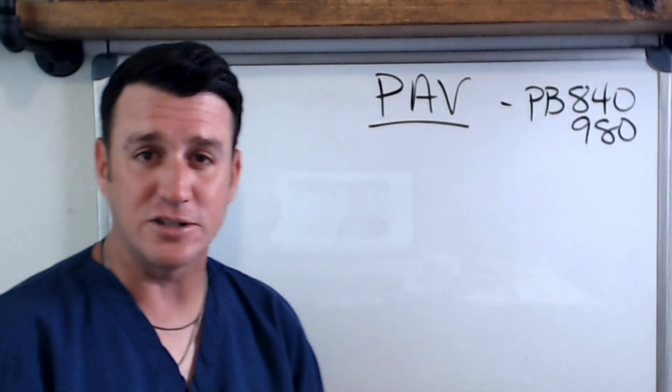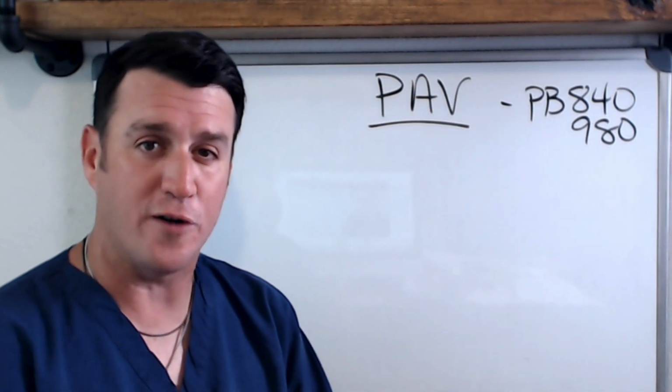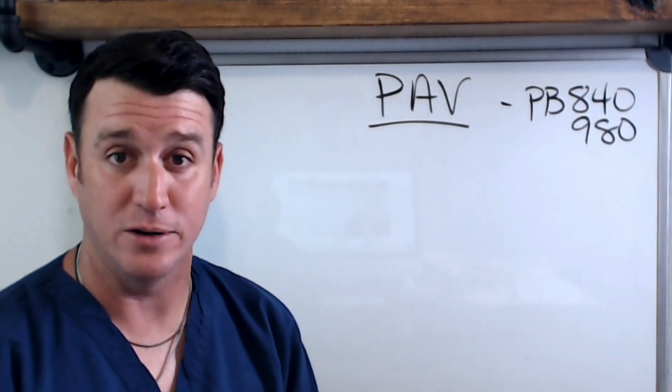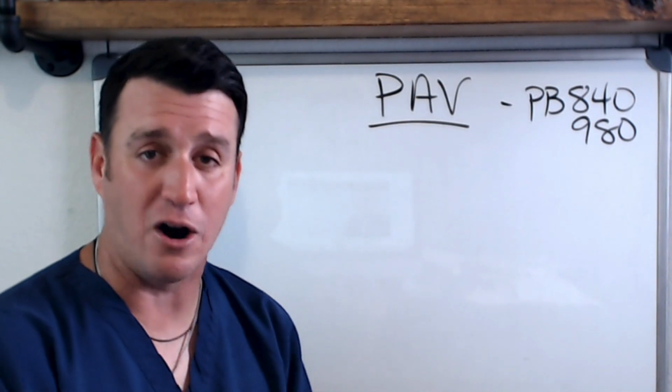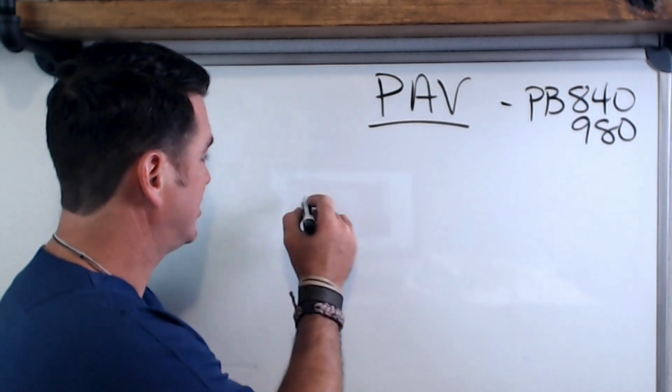Now, the other thing you need to understand is that this mode works off basically the equation of motion, okay? Now, I'm not saying that this is the algorithm that PAV uses. I'm just going to say in general, the equation of motion looks something like this.